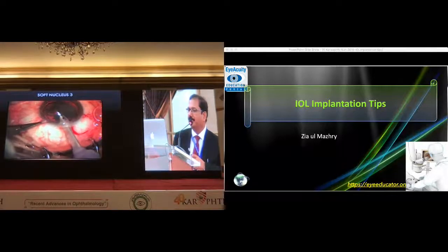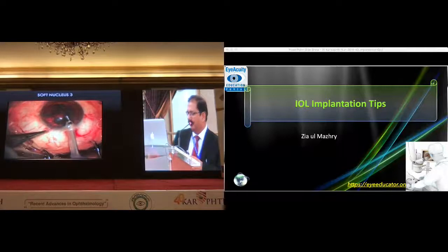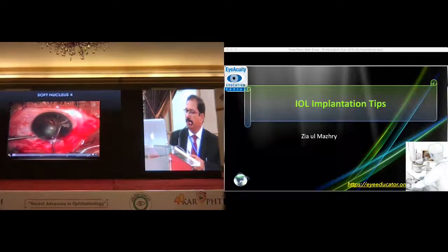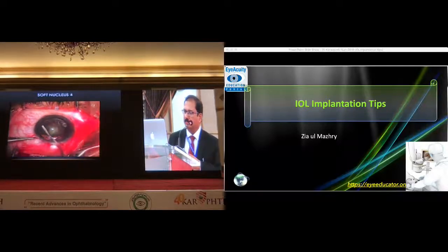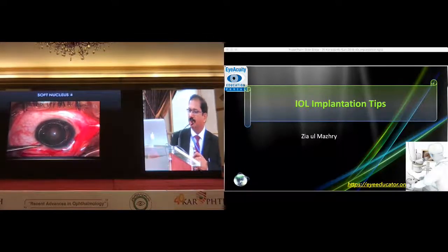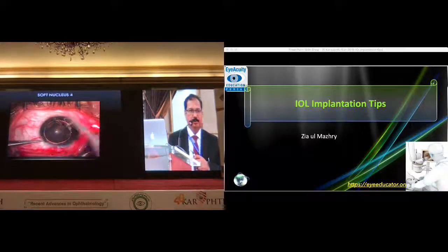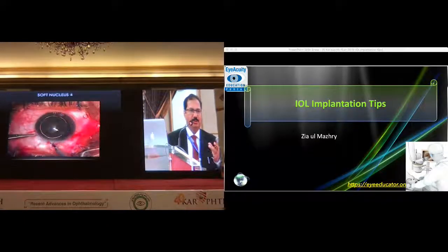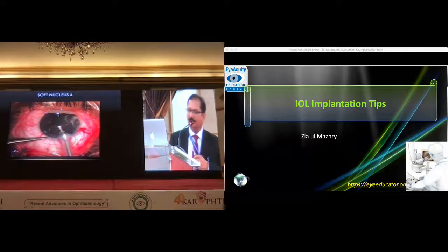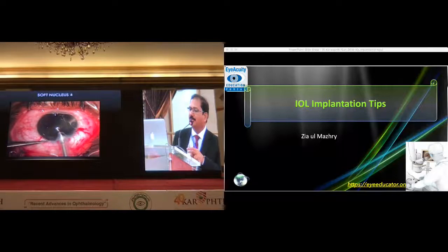This is slightly harder to get. This is turning. This is taking more than five seconds. It can easily come out, but it is very soft so you can just push it. It is soft and you can hydro-delineate it to make it more manageable. In the next case I will show one that is slightly harder, but it can also be taken very easily with this technique.